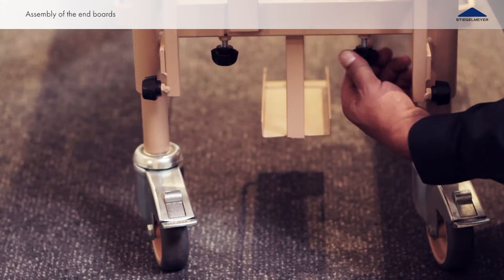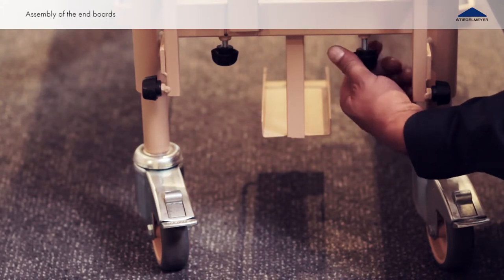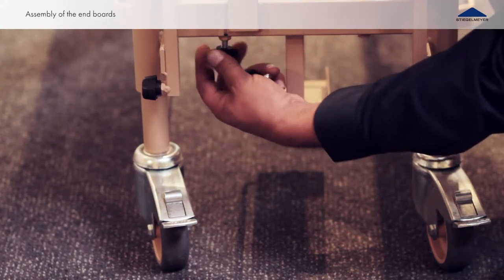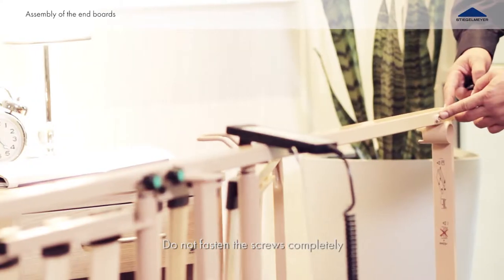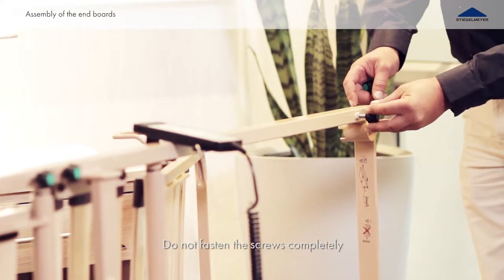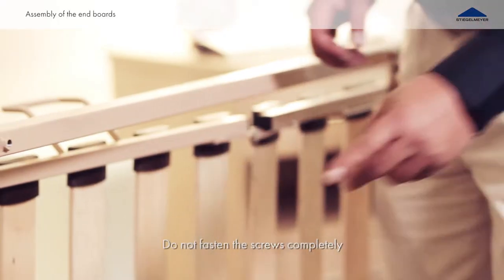First loosen the two knurled screws on the transport aid by the headboard, then the two knurled screws by the footboard. Use these screws to affix two at the head side on the reclining surface, and then move to the foot side to affix the other two knurled screws.